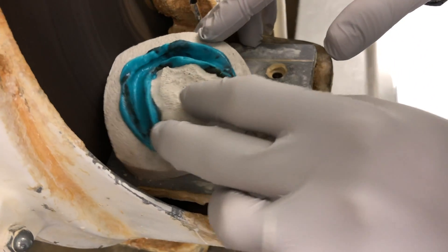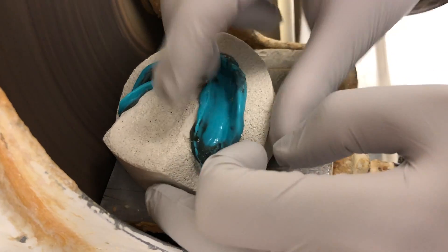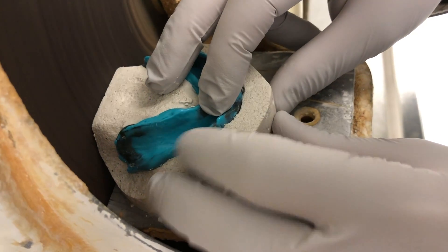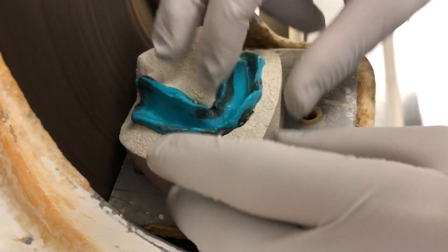Once hardened, trim the plaster and pumice impression to preserve about 5 mm of land area around your impression. Care must be taken not to over trim the plaster and pumice, as the material is relatively soft for the trimmer.